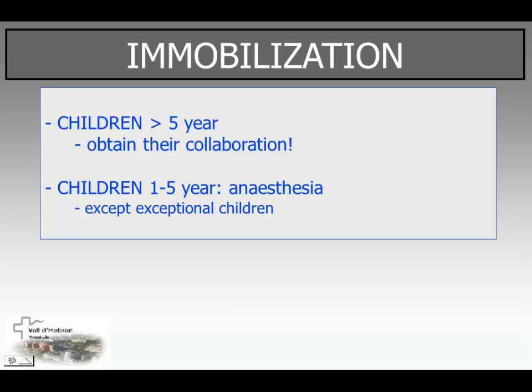In these cases, we always order an anesthesia, except in a few cases of really exceptional children who visit us or visit the MRI department quite often, in some cases from 3.5 or 4 years, and then we don't need anesthesia. But we prefer to have the pediatric anesthetist there and to decide at the last minute.